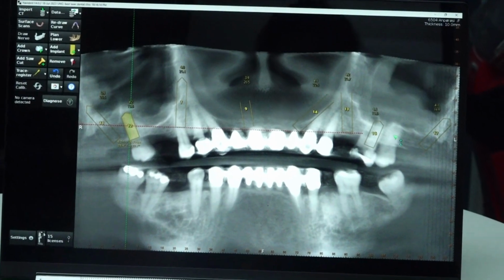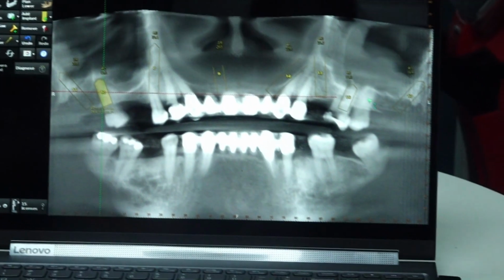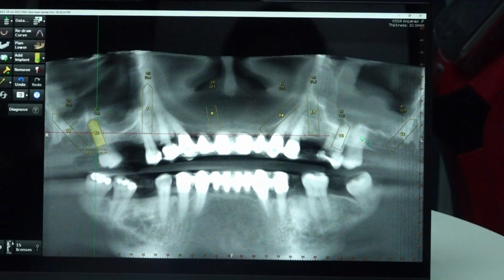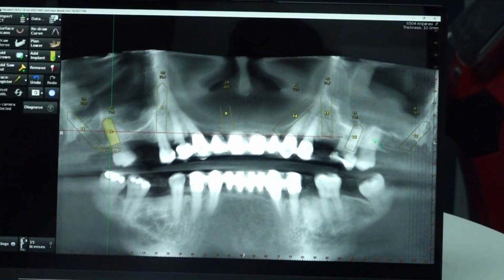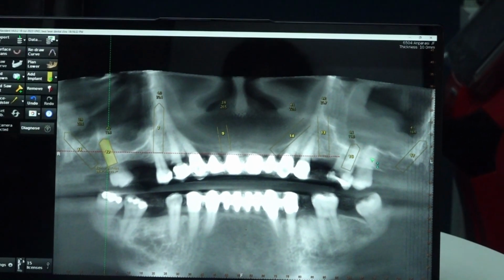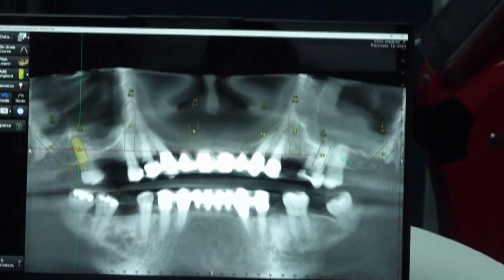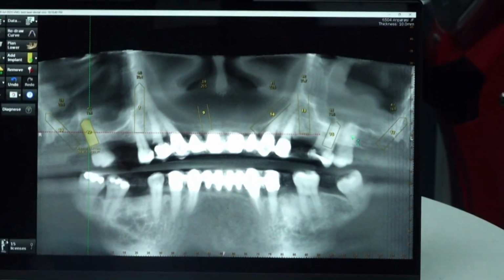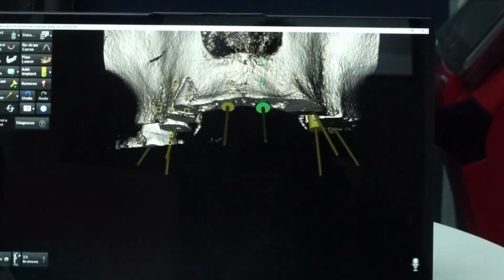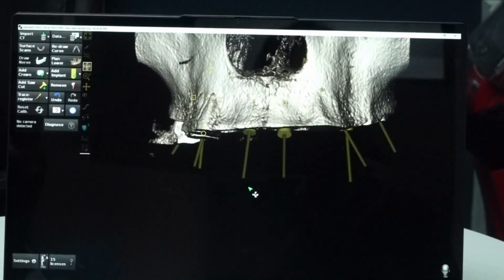If you have screw retained, you don't have to place this in-between small implant. There is no need. It will actually complicate the screw retained process. Just 6 implants is more than enough. But if you are planning for cement retained, for this patient, I am telling, knock out the pterygoid. Don't put pterygoid. Put molar implant, palatal socket. They are good implants. The anterior implants also are good. The only challenge will be in extraction. We should not break the buccal plate. If you break the buccal plate, then everything goes into trouble.